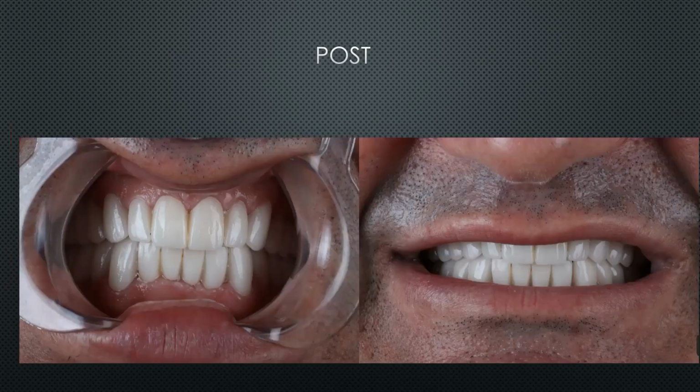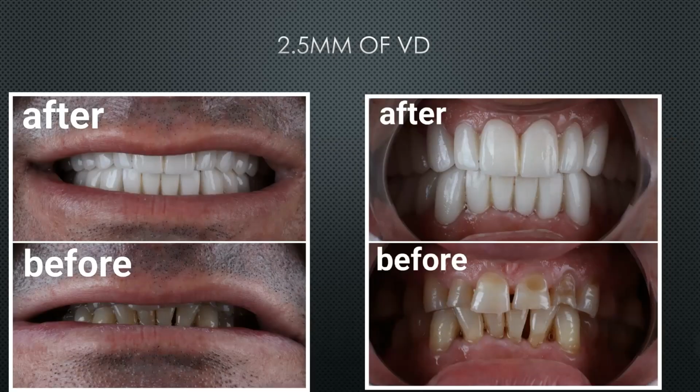This is another photo. If you look closely how his opening is increased, his vertical dimension is higher. I think the color is A1, patient chose the A1. So we make the preparation all at once. I'm a left-handed dentist. I started with left side and to the right side, upper and lower together.